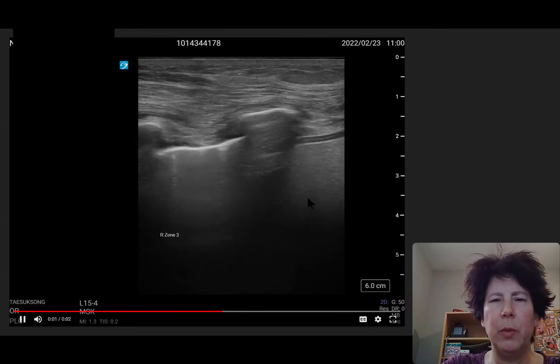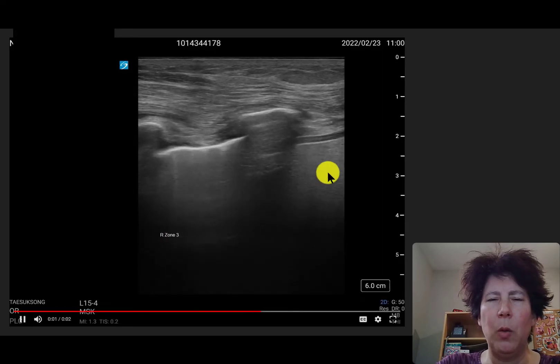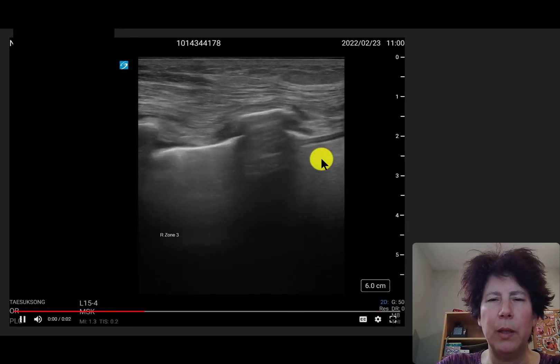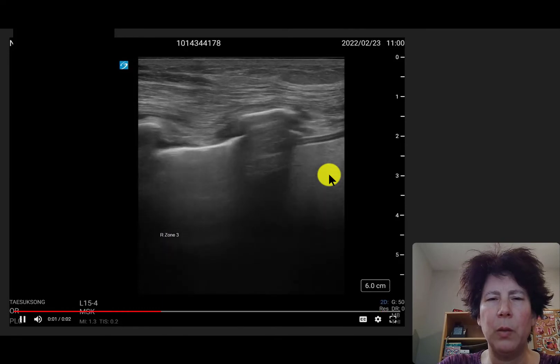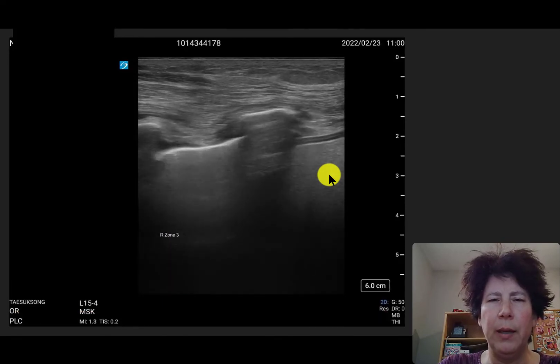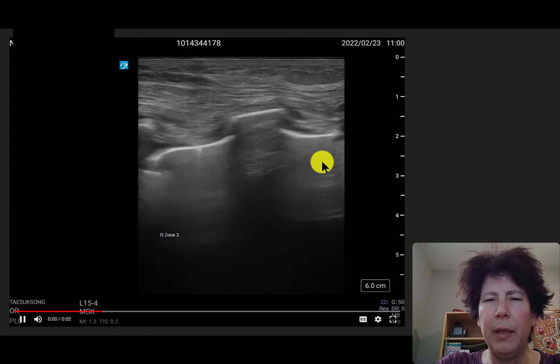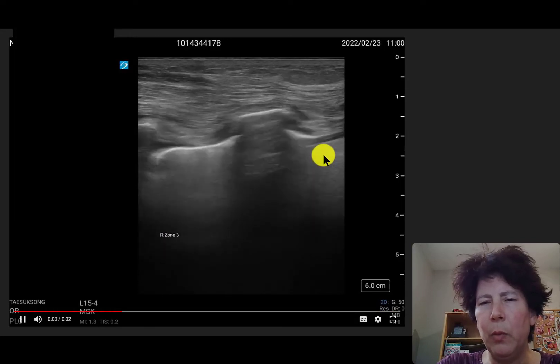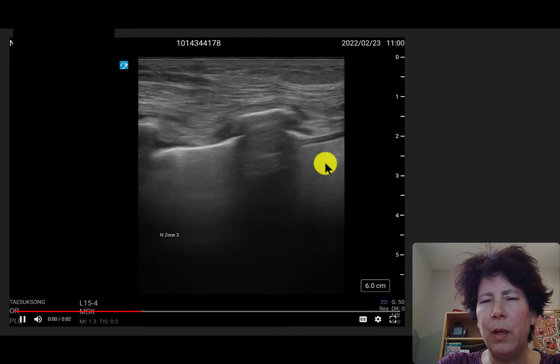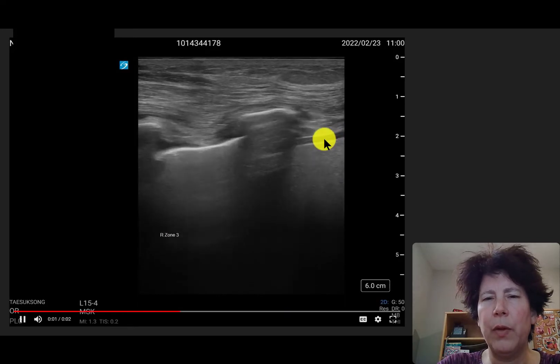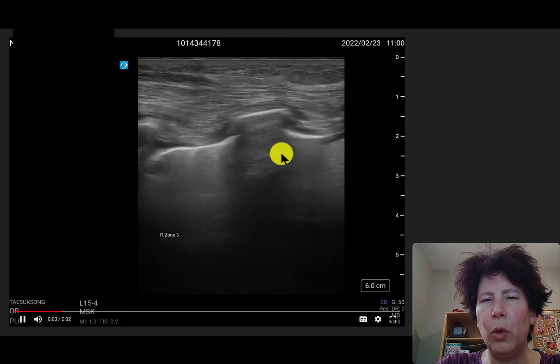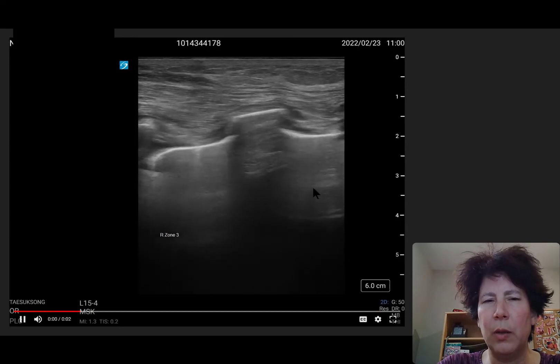On the next picture we have this image that almost looks like a lung point. This was kind of zone 3, and Tay was wondering if there was some kind of pneumothorax. But looking at the image, I think what we're probably seeing here is more a lung transition zone, where we have lung collapse in this area and pleural effusion, with more normal lung pushing down onto that collapsed zone.